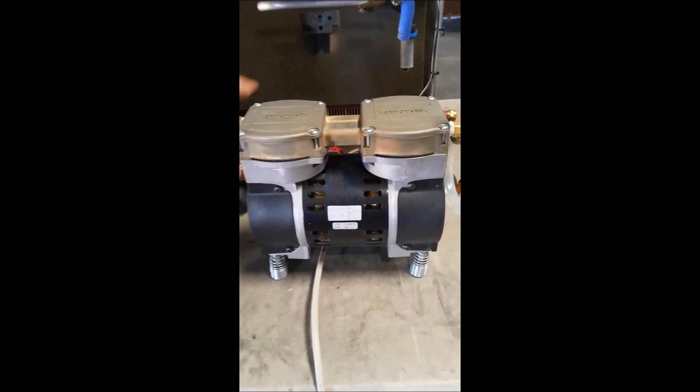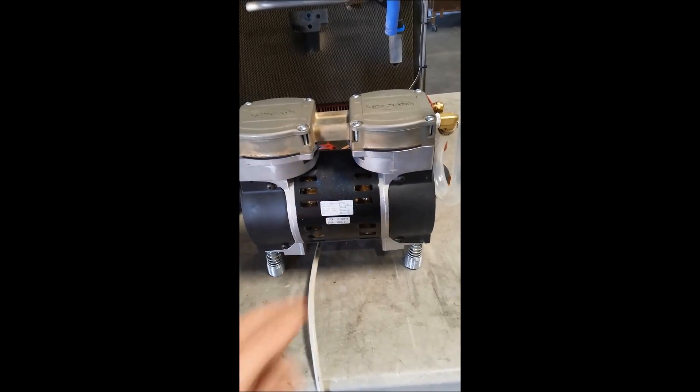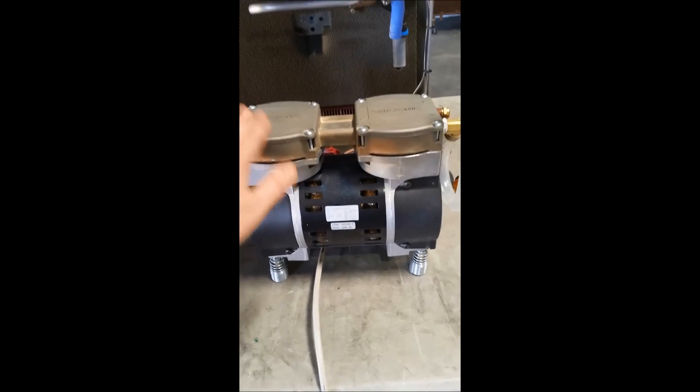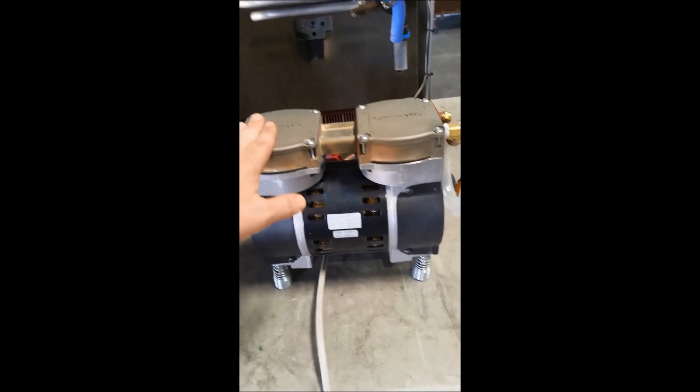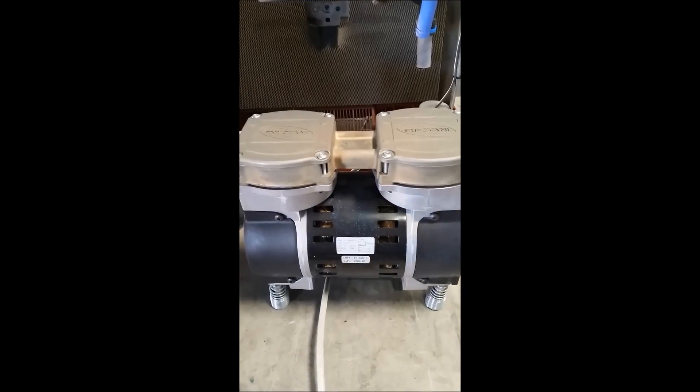Once you remove the compressor, spin it around so you get the back facing. Just look for these tags — you'll know it's facing the right direction. Even though the compressor is still connected to the concentrator from the wiring, you're able to work on the rebuild. This will make it a simple fix.